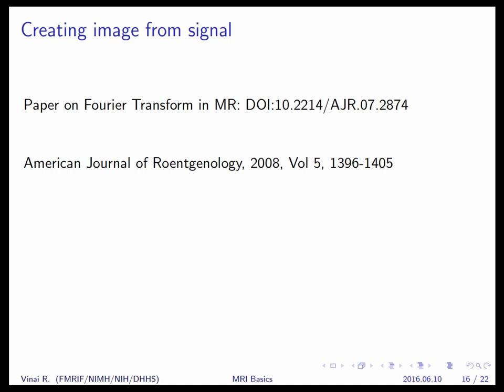There's actually a PNAS paper with Yablonsky that looks at brain activation, claiming that he sees a very, very small temperature shift, and it's MR phase, which is sort of like T2. But temperature mostly affects diffusion of the spins, which you can probably measure by looking at the diffusion coefficient a little bit, maybe.